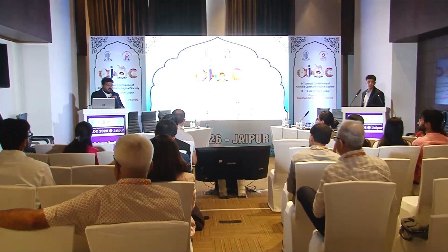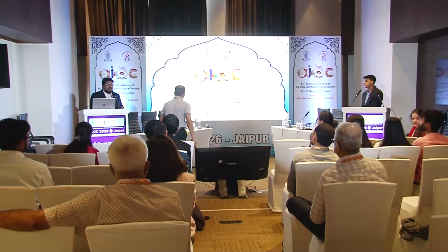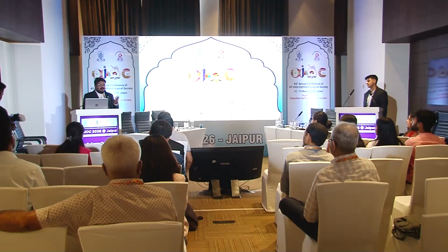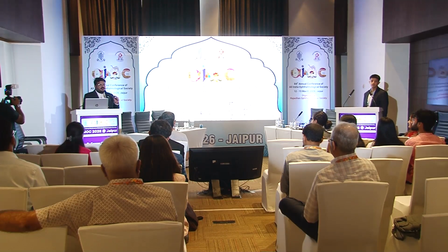So the images can be of two types. One is you see a very rare condition which mandates photography. So you are seeing a case once in a week, or a case that you have seen in a long time, that you're seeing for the first time, definitely photograph it. Or if you see a typical case but you are seeing an atypical finding, even then you can photograph. But routine imaging may be difficult in a very busy OPD setting. So if you have access to imaging or someone else is there to photograph, definitely you can.